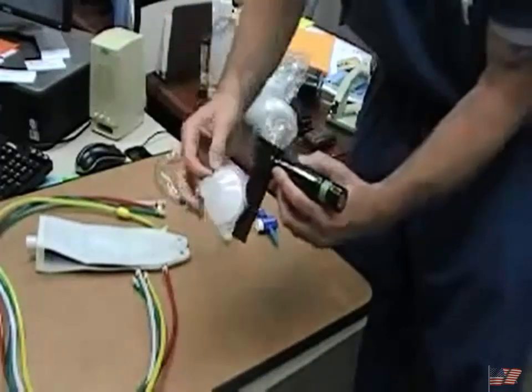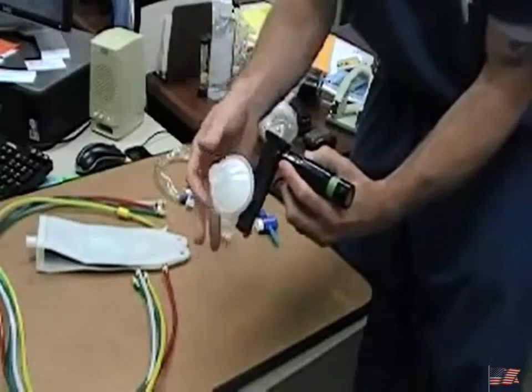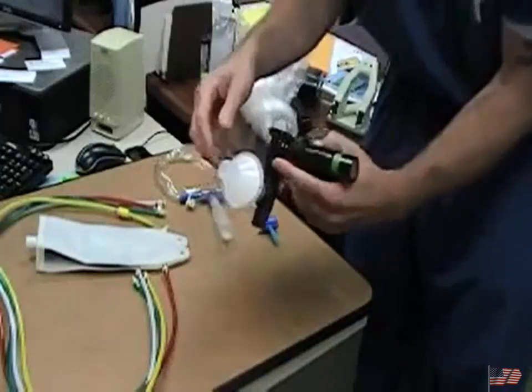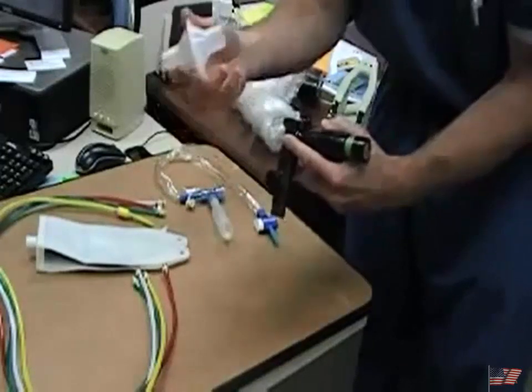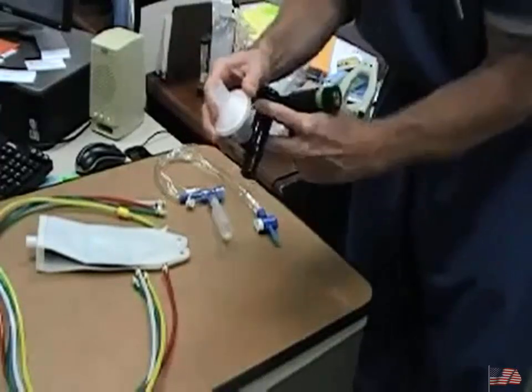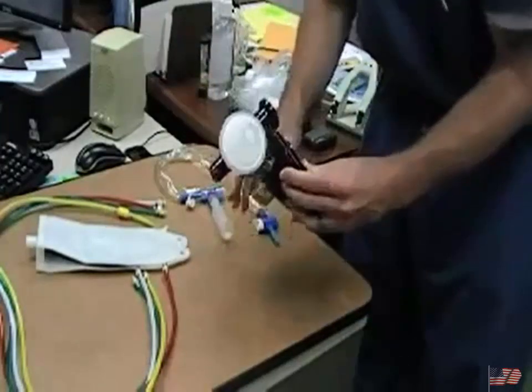Alright, so we'll have some moisture that kind of comes up here, right, and this can just keep that from splattering everywhere. Recommended change out is when this gets pretty saturated because it can increase resistance levels a little bit. Alright, now we have this put together.